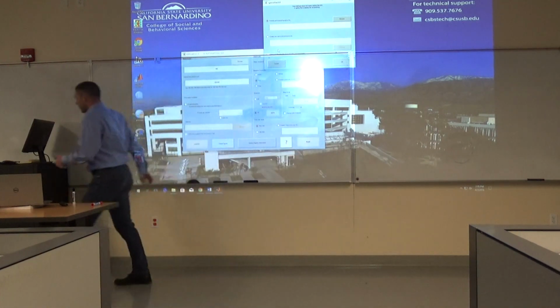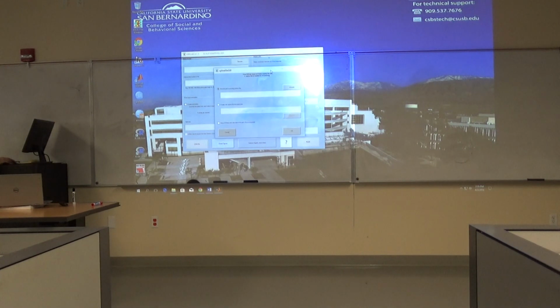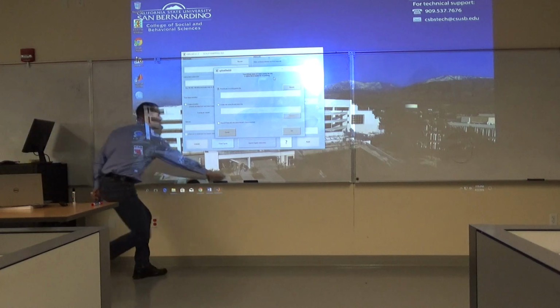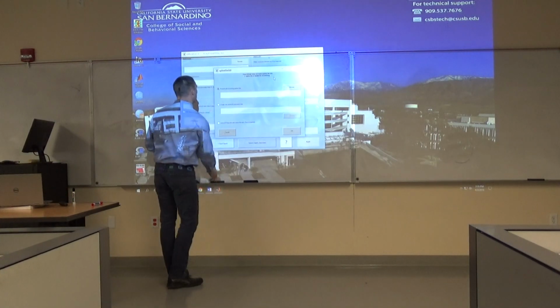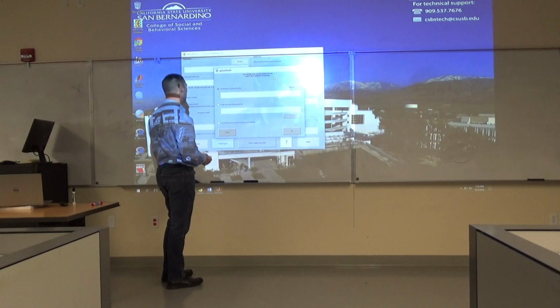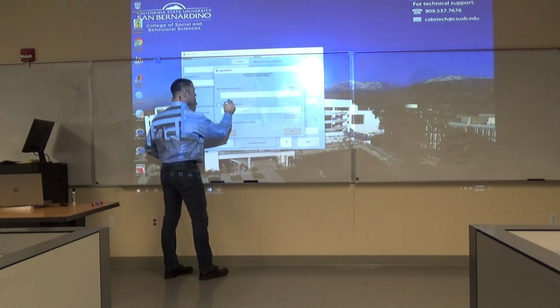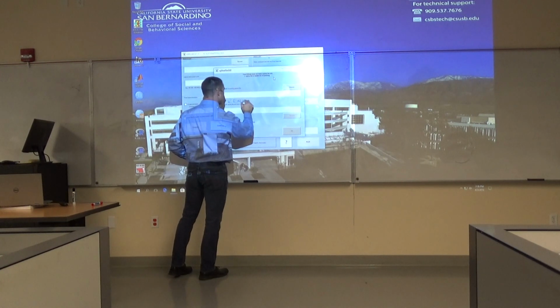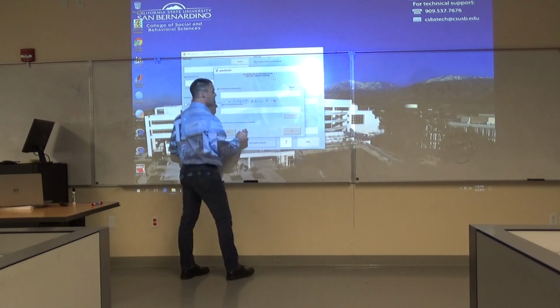Okay, I'll bring this down over here. And okay, so when it asks us this information, we want to create a new one. Create a new file, and it's going to ask us where we want to save it.